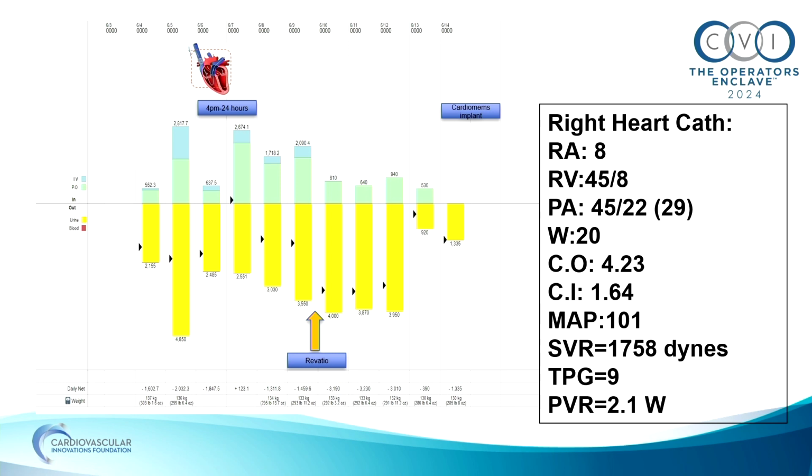In this patient, he got the Precardia device up here. It was only a 24-hour placement because it's an early feasibility study. And for 24 hours, the urine output didn't change much. The diuretics did not change per protocol. And then the Precardia device was taken out. But interestingly, without any change in diuretics in this individual, these are the urine outputs that continue to increase.